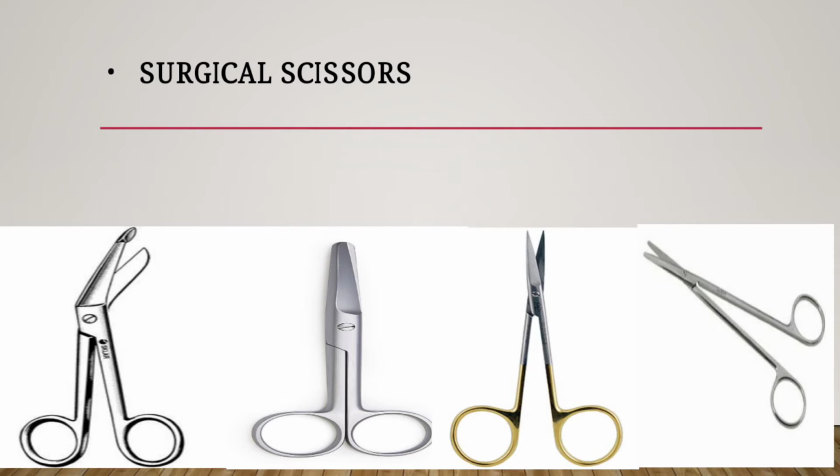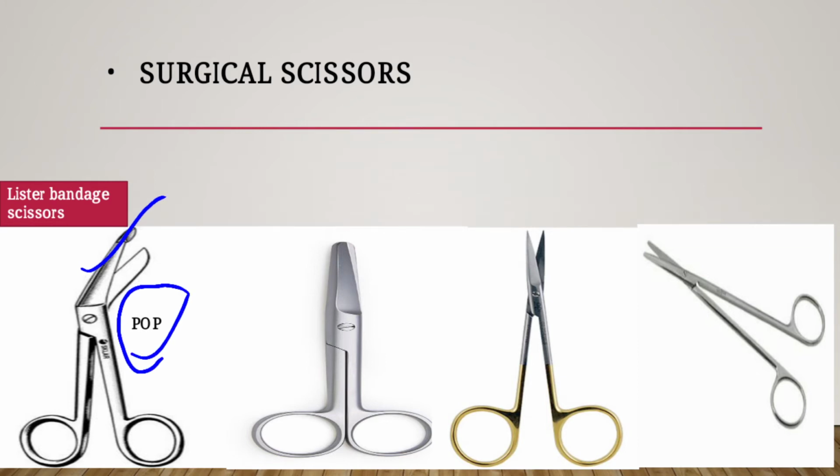Surgical scissors are of various types, named for their proper uses and functions. Number 1 is the Lister bandage scissor. Its jaws are curved, and it is mostly used in cutting plaster of Paris. Another one is Mayo scissors. Mayo scissors are used to cut muscles and soft tissues.